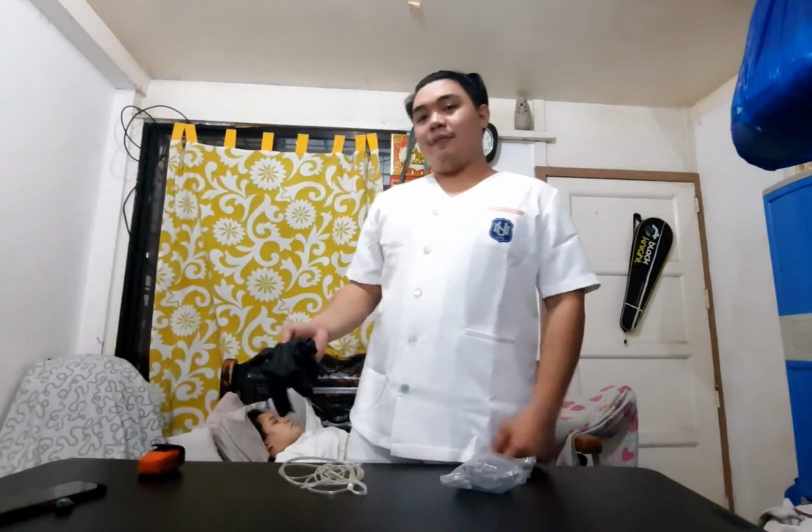So in this video, I will be demonstrating administering oxygen therapy. Here we have the nasal cannula, the simple face mask or the non-rebreather, partial non-rebreather mask, the gloves to avoid transferring microorganisms to the patient, and then the pulse oximeter to check the patient's oxygen saturation.